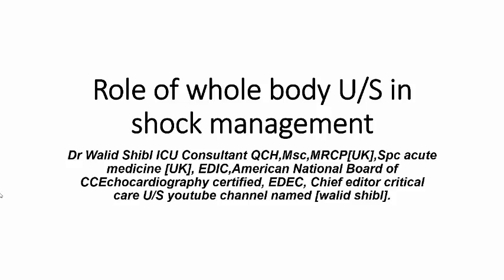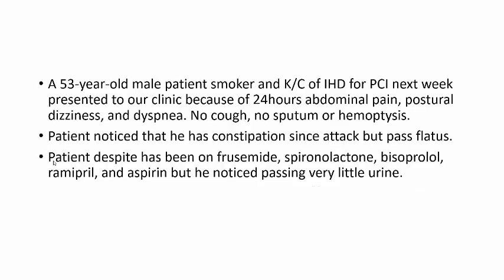I'm so happy to meet you again in this very important project, role of whole body ultrasound in shock management. Let us see this case. A 53-year-old male patient, smoker, known case of ischemic heart disease, for PCI next week. When I saw the patient, he was planning to do PCI in the next week.